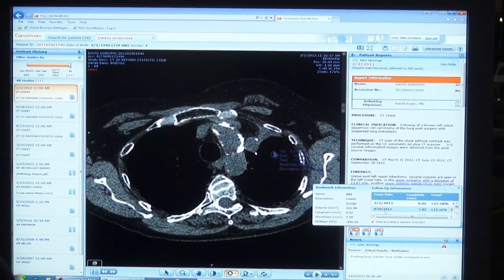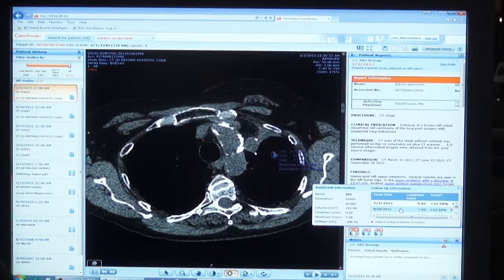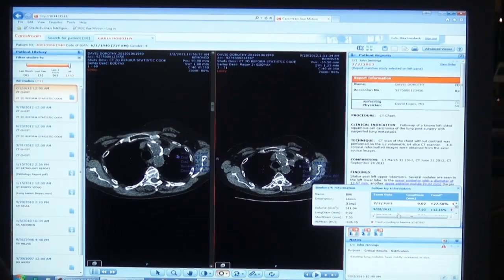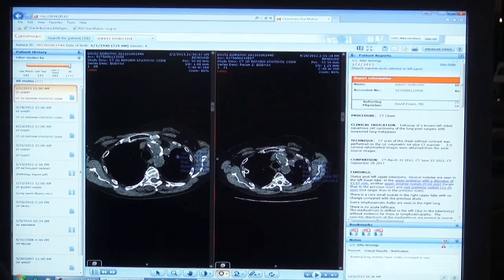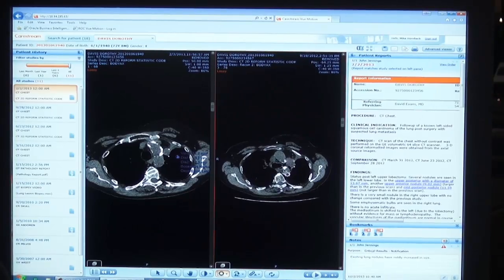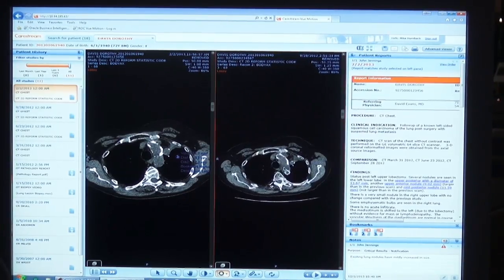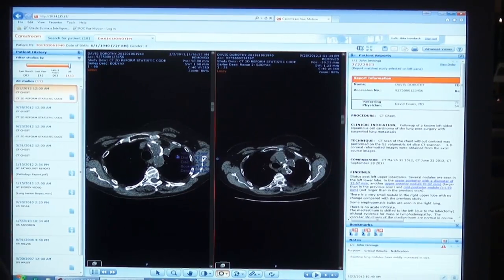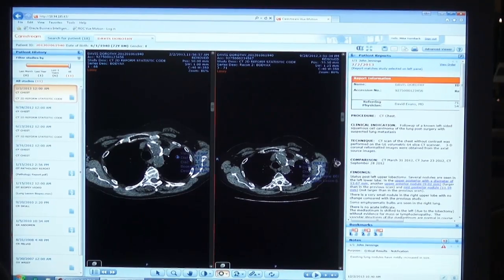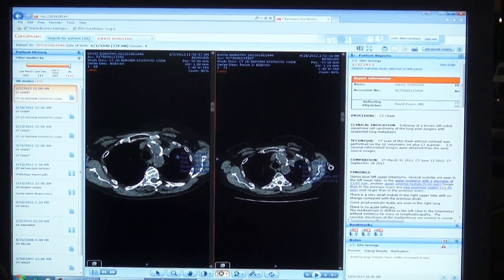So if I want to see a bookmark that was indicated in the last study, I simply click and it splits my screen in a one-by-two view and brings both studies up — not just the key image, but it brings the entire series right to that slice where the bookmark is, with the annotations for volume and measurements.